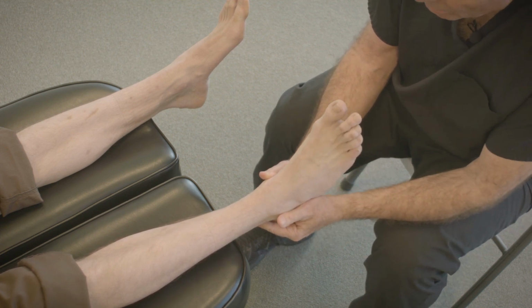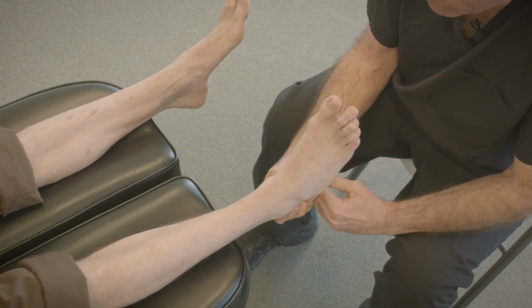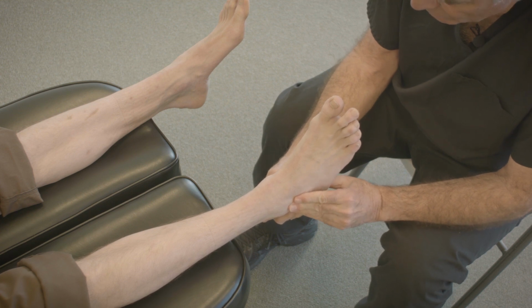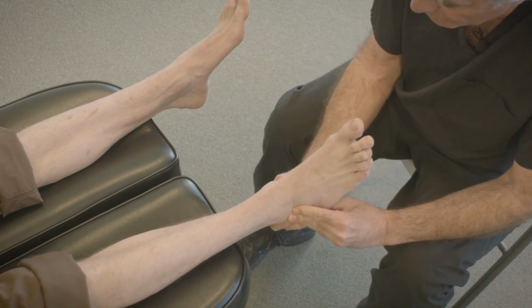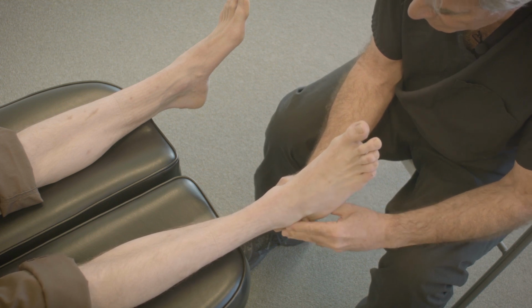When I watched you walk down the hall, you landed slightly on the outside of your heel, which is normal, but then your heel moved in this direction, which we call pronation. And that's your subtalar joint moving, and it moved all the way out to this direction.